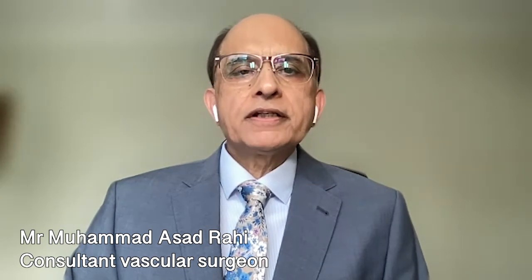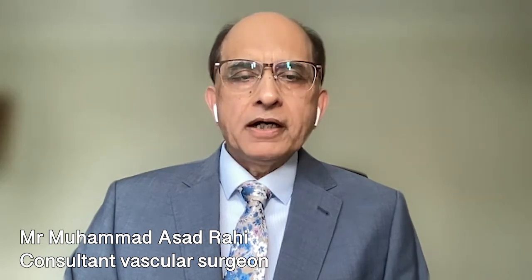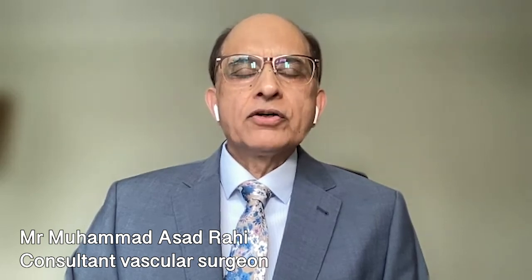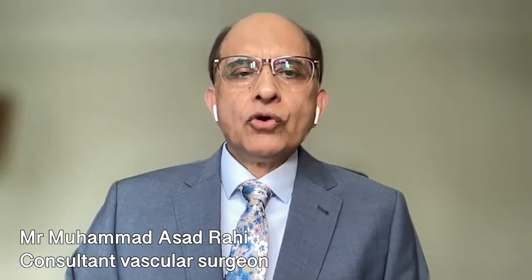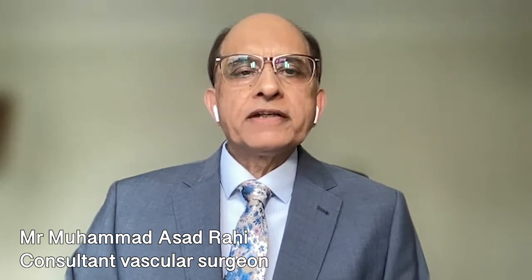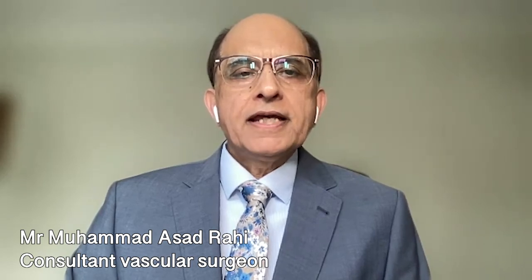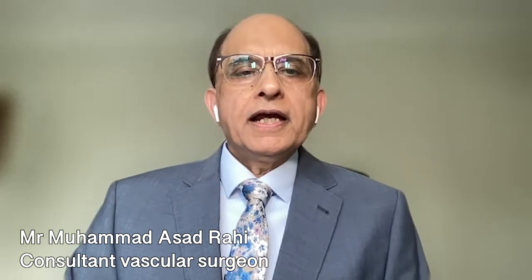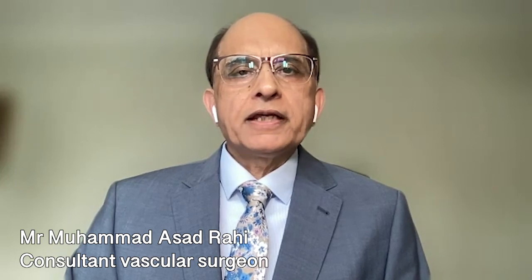My further recommendation is to avoid sporting activity, hot baths or strenuous exercise for the following 5 to 7 days in order to prevent the opening up of the vein. But normal activity, normal working is absolutely fine, and that is one of the biggest advantages of EVLA. There is 99% durability and an excellent result with EVLA, and patients have maximum satisfaction with EVLA in my experience.